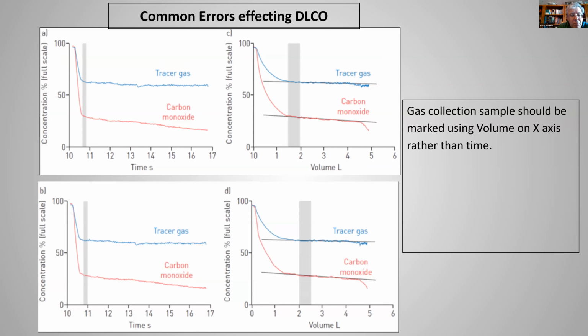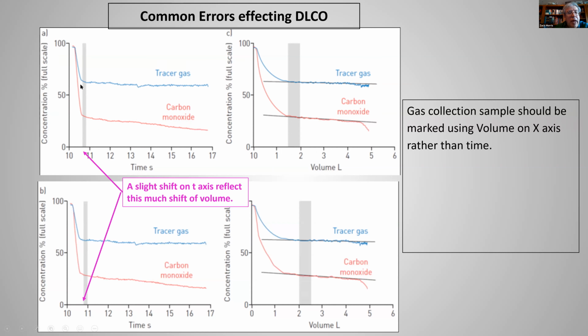And here's the exact same patient. And what happened here is the tech says, I'm not real happy with this point. I think maybe a little further down. And so instead of marking it right there, they're going to shift it down a little bit to where they think it's maybe plateauing here. Gas is still coming out.